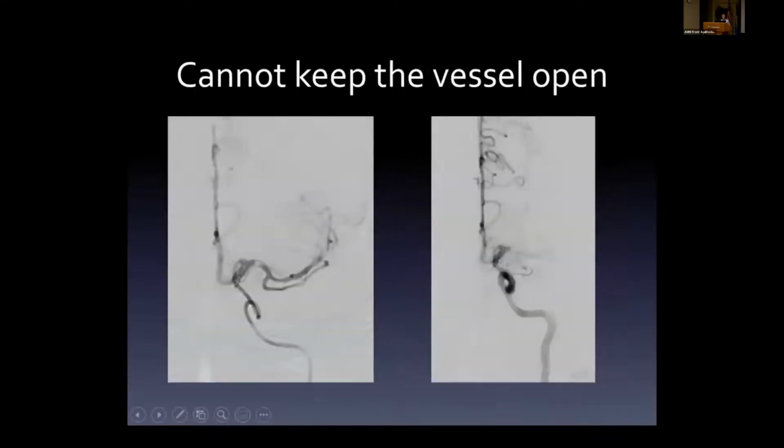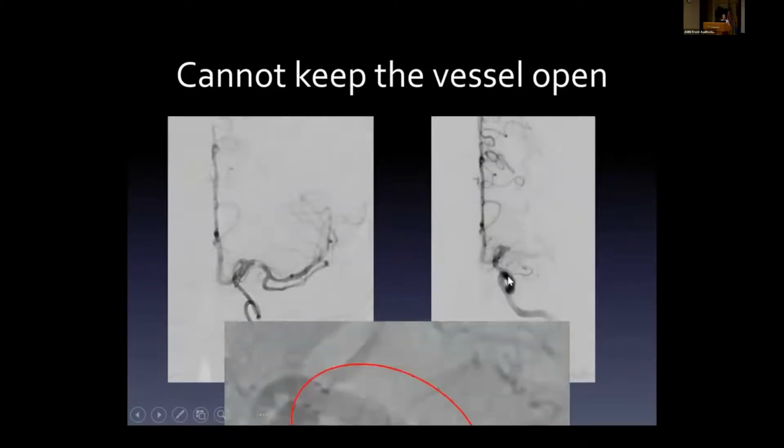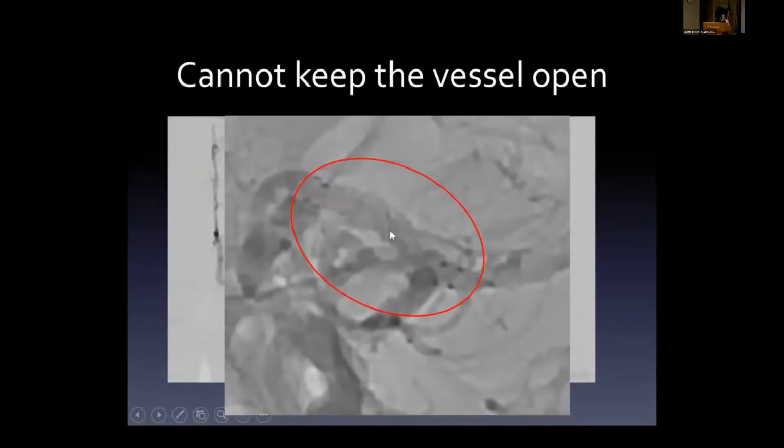And then there's a situation like this gentleman. This is an atherosclerotic plaque. Here you can see you've got darkness here and darkness there, all the contrast that's going through, but you see this little rock here. This is atherosclerotic disease. I went after this with everything I knew, ballooning, everything. And despite my best efforts, it would stay open for about 2 minutes and then it would return to this, which is most frustrating. And this is a gentleman that I had to put a stent in to keep that vessel open, which again sounds like a reasonable thing to do.